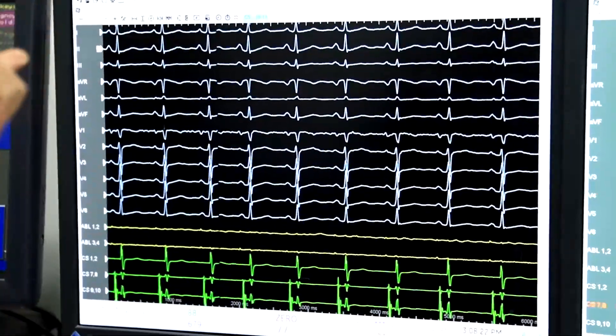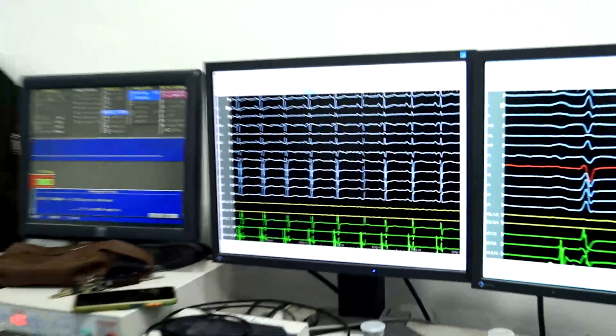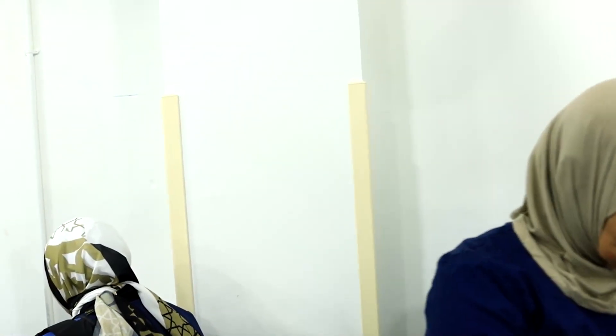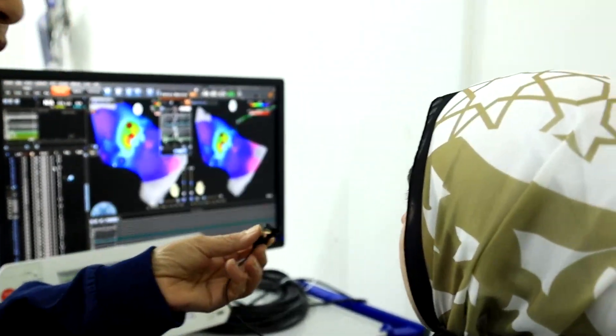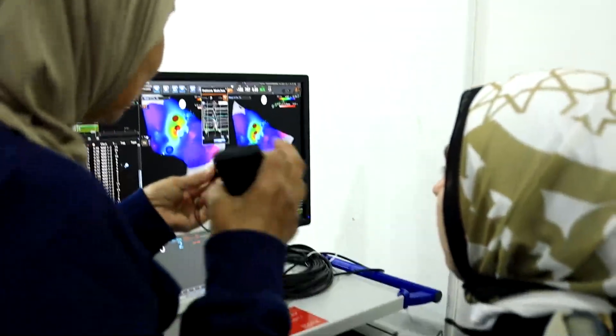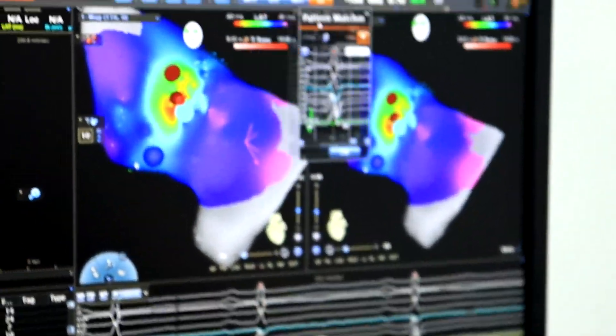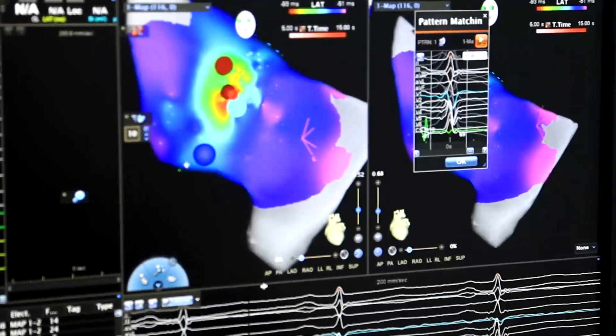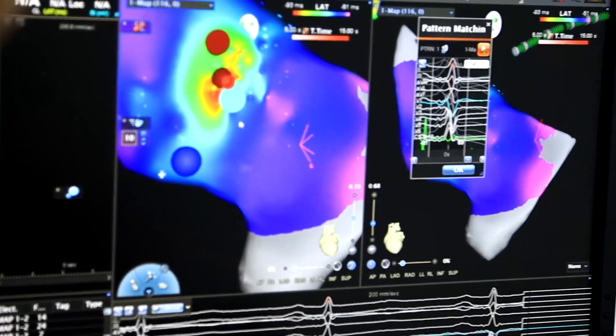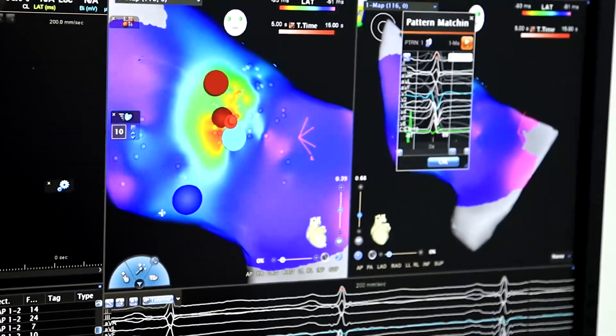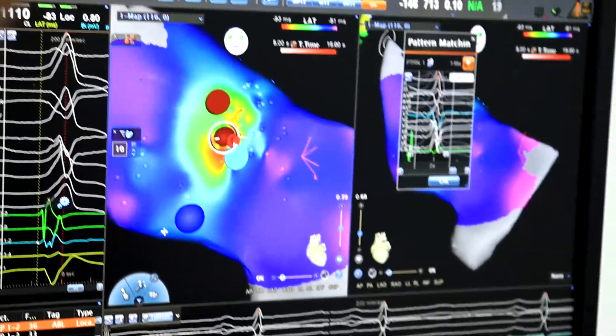Now we are live in the cath lab and we don't have any PVC after almost 20 minutes, 30 minutes follow-up. We'll see the location in the carto. Rahma, yes, we only mapped for the PVC. We did not make a whole map. We just mapped the LVOT and mainly the position was at the commissure.